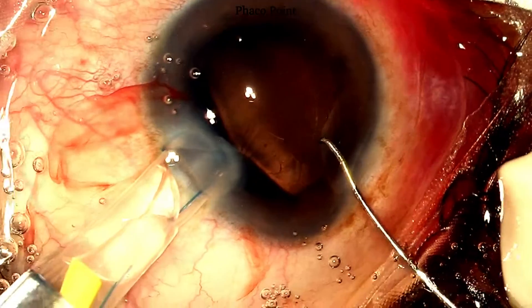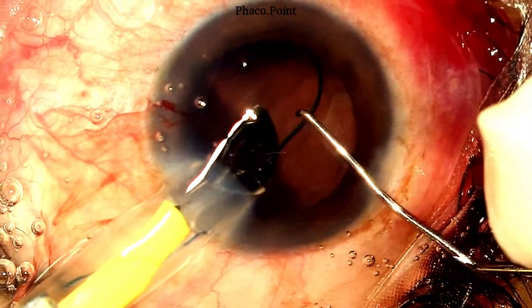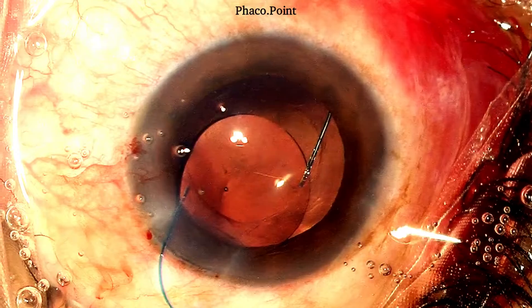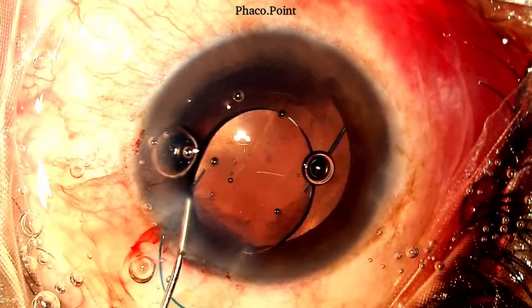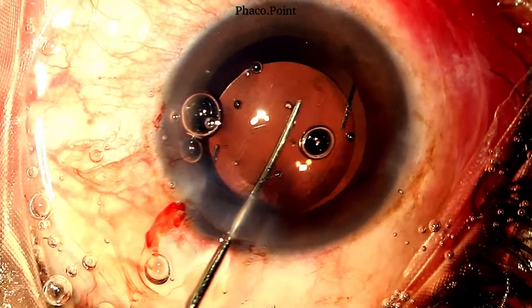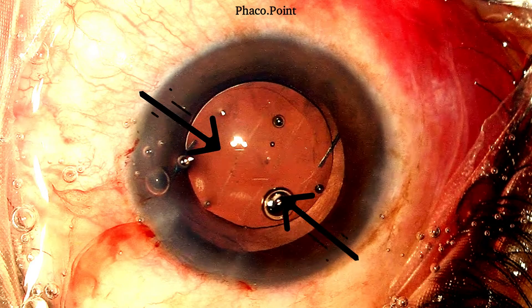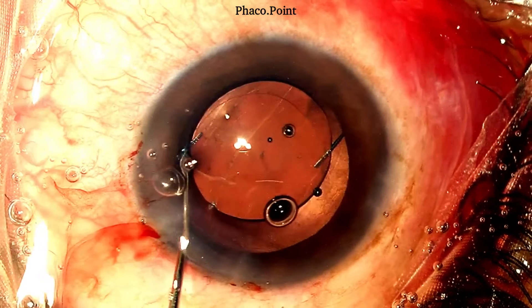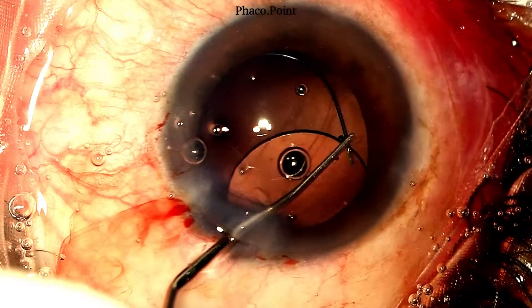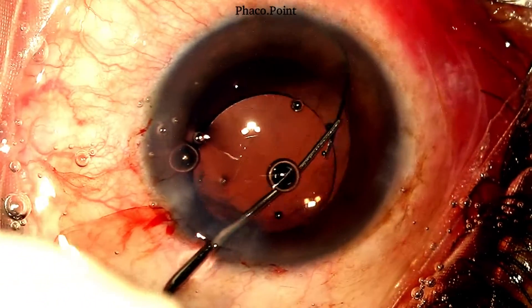The second instrument affords counter-pressure. We must ensure at every point that we do not lose any viscoelastic, because shallowing of the anterior chamber would again allow for vitreous prolapse. The leading haptic should find its place in the ciliary sulcus. Following introduction of more viscoelastic to deepen the anterior chamber, the trailing haptic is introduced and rotated into position in the ciliary sulcus with the help of a ball tiler hitched at the inferior optic-haptic junction. In an attempt to reorient the haptics with respect to the PCR, the IOL is rotated, but unfortunately the lower haptic slips out into the anterior chamber. Under adequate viscoelastic, it is then rotated back into the correct position in the ciliary sulcus.